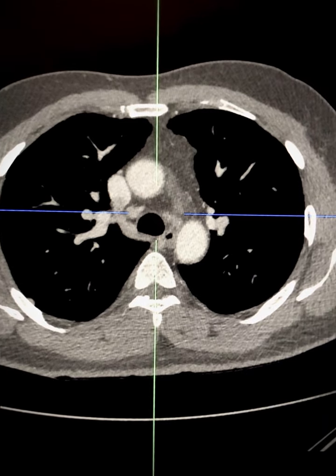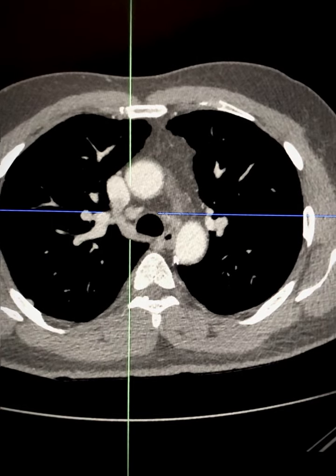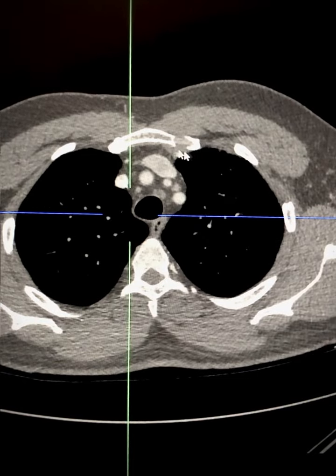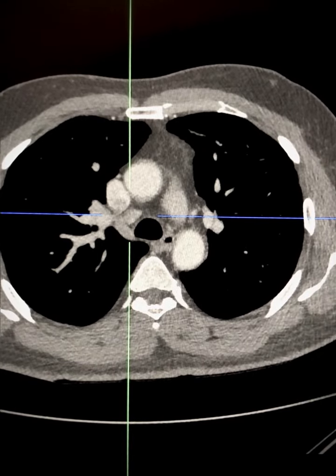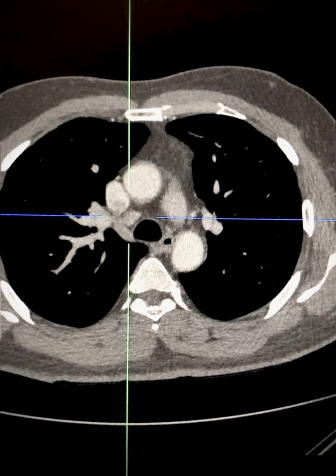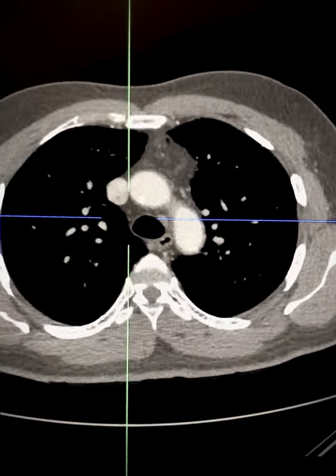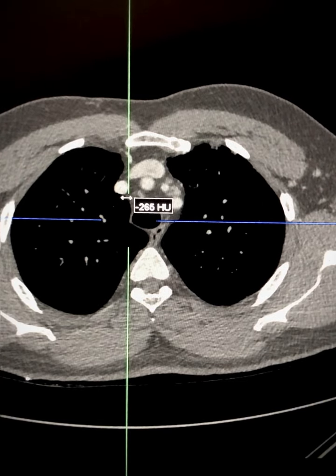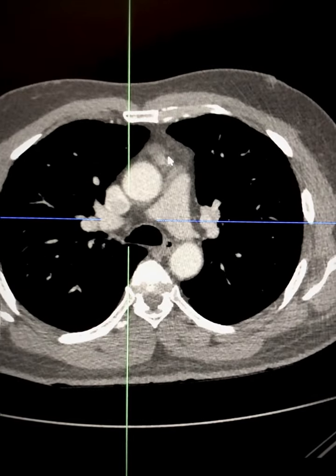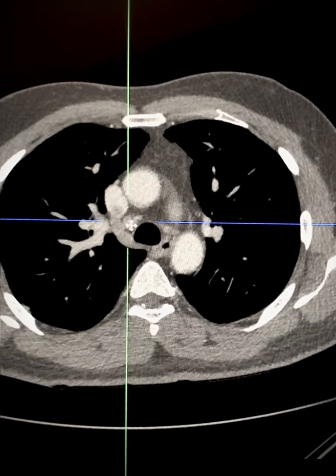We're going to focus on the right-sided node first. This node is a 4R node, and the landmarks are this structure here, which is the left brachiocephalic vein, and this structure here, which is the azygos vein. For the 4R nodal station, the superior extent should be below the left brachiocephalic venous entry site, and the inferior extent should be the inferior border of the azygos vein. So this node is a 4R node.